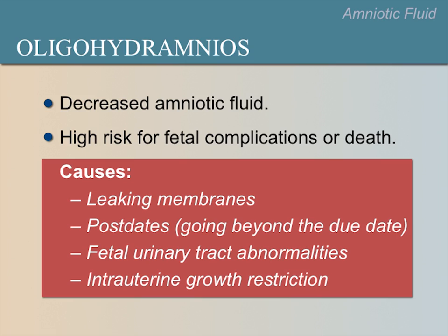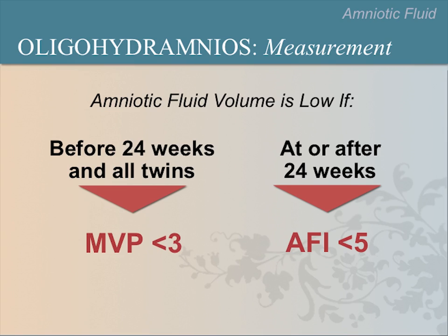The fetus will appear crowded. Because of the lack of fluid, the fetal parts are more difficult to see clearly. This will be easier to understand after more hands-on scanning. There are two ways to measure oligohydramnios. Use only one of these methods and not both.